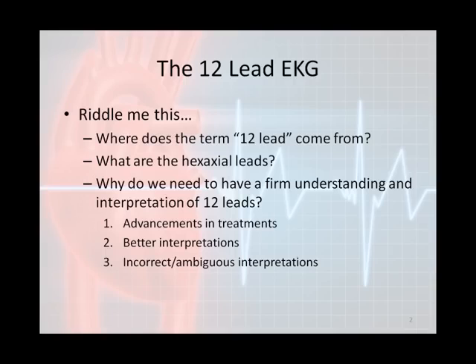So for these three reasons, people should be able to interpret the bumps and squiggles, as it were, on a 12-lead and not just read the interpretation at the top.